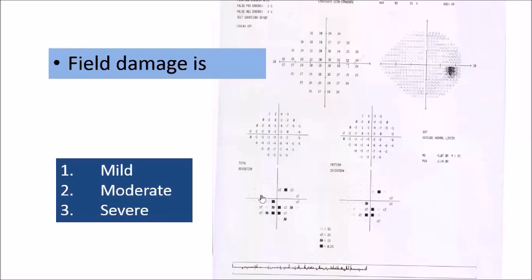So actually, I don't agree with the third choice. This is mild glaucoma. I don't know why people choose moderate, because I just depend on that. I will ignore that. Or maybe some people will go and choose that there is multiple affection of one of the two hemispheres according to the American guideline. Then we'll say this is mild glaucoma. This is the rationale for such a difference in the decision. So simply, yes, it can be mild if you want. If you go for the Canadian, it can be mild. If you go for the American, it can be moderate, but it is not severe.